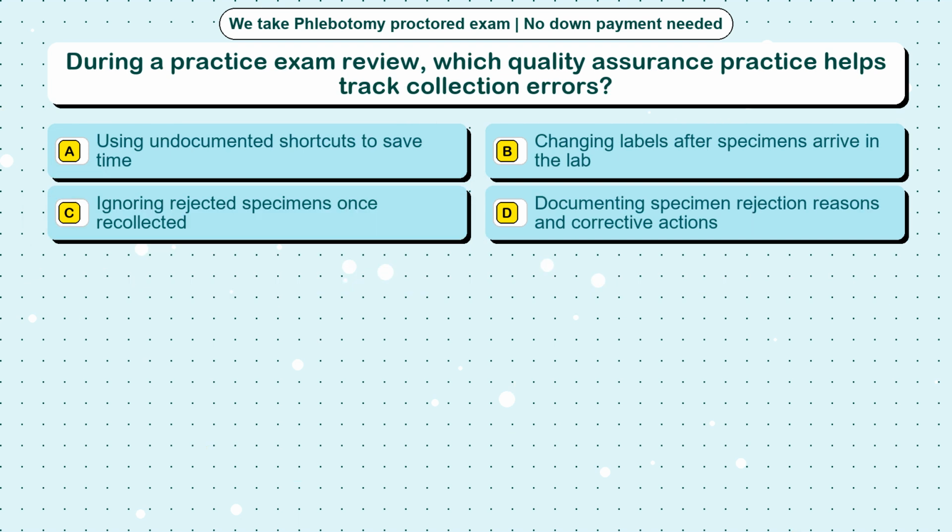Question 22. During a practice exam review, which quality assurance practice helps track collection errors? Option A, using undocumented shortcuts to save time. Option B, changing labels after specimens arrive in the lab. Option C, ignoring rejected specimens once recollected. Option D, documenting specimen rejection reasons and corrective actions.